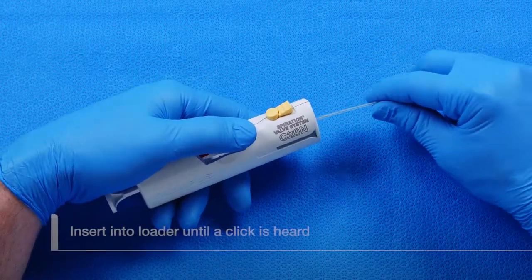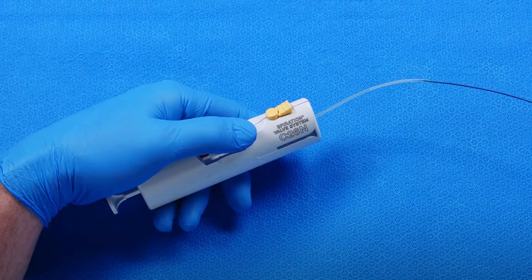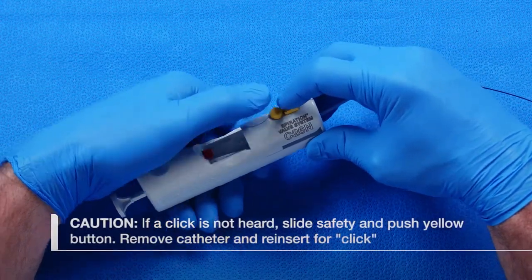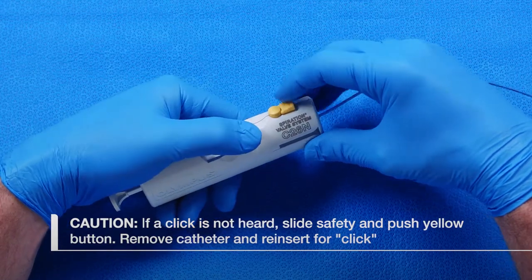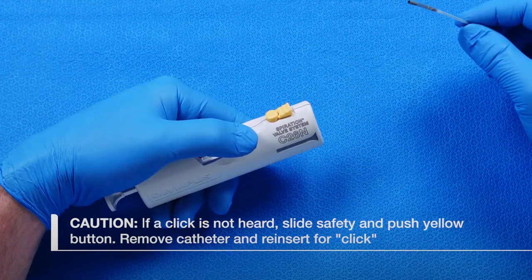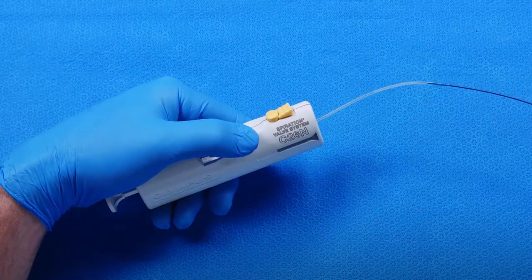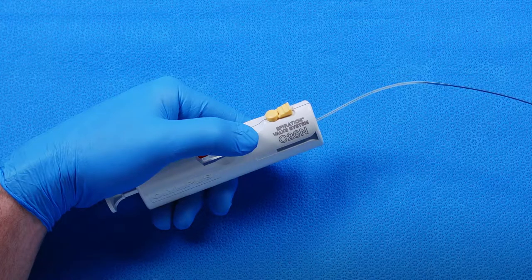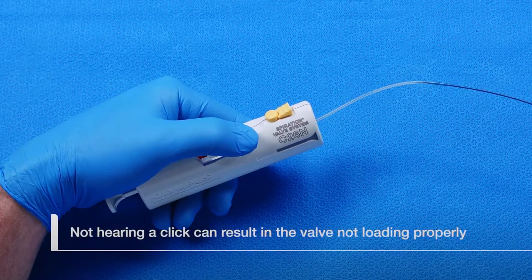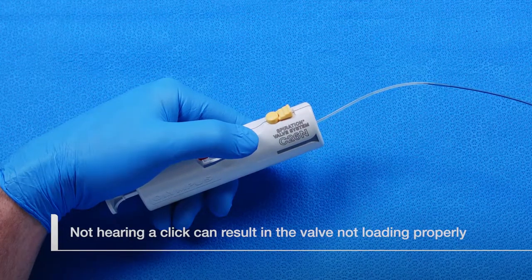Grasp the catheter so that it can be fully inserted into the loader without kinking or damage. Insert the catheter into the loader until an audible click is heard. If a click is not heard, release the catheter by pushing and holding the catheter release safety slider forward, then press the catheter release button down. Remove the catheter from the loader and reinsert until an audible click is heard. Not hearing a click means the catheter has not been properly locked into place inside the loader and the valve may not load properly.